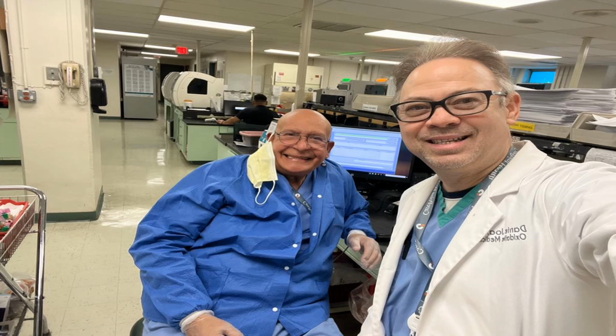This is part of the lab and where the blood work is being performed. So every site that they take your blood belongs to the pre-analytical phase. But as soon as the blood gets into the lab, now it's going into the analytical or the examination phase. Like in this case, this is the lab setting and this is where blood is going to be analyzed.